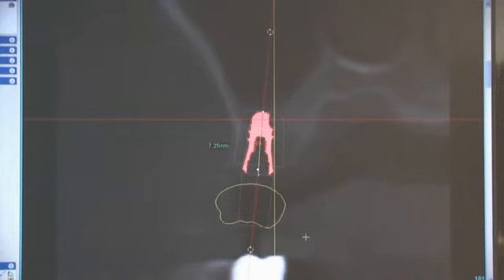The designs of implants are changing. We're seeing these real short implants all the time. They're trying to address problems that we have every day in our practices. So the implant software really allows us a lot of versatility and helps us establish a true comfort zone for the wide range of experiences that clinicians have.